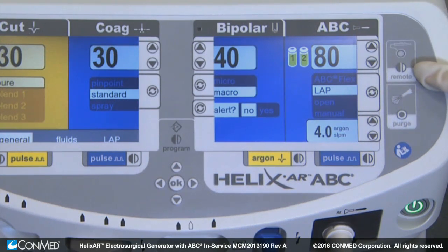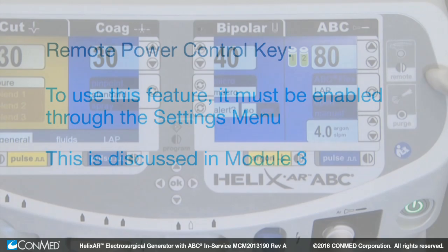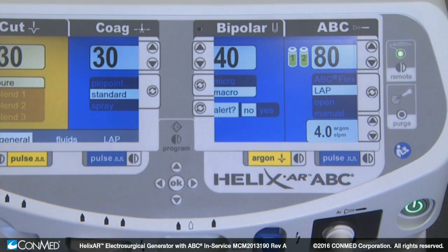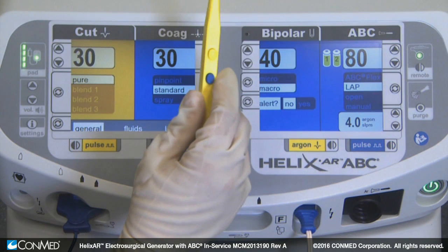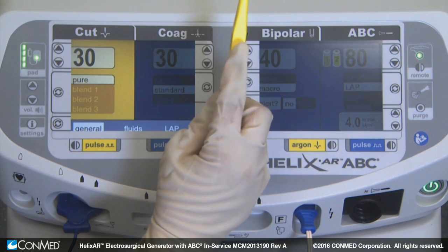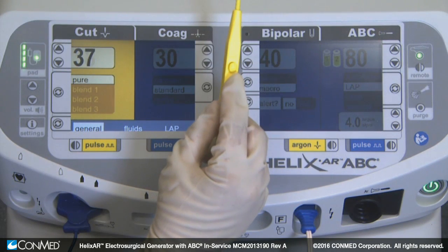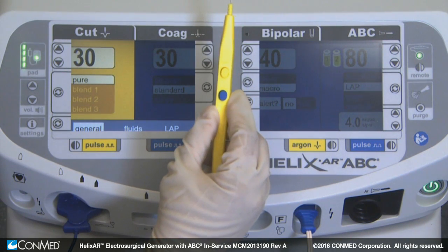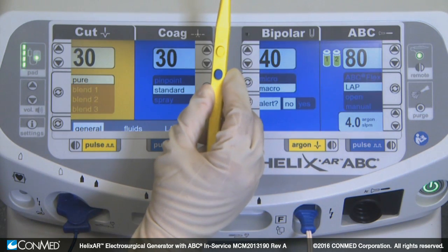On the top right of the generator is the remote power control key. To use this feature, it must be enabled through the settings menu, which is discussed in Module 3. The indicator illuminates when remote power is selected. This allows the surgeon to change cut and coag power settings from the sterile field using an active electrosurgical accessory. The surgeon can double-click the cut, coag, or ABC button on the handpiece, increase power by pressing the cut button, and decrease power by pressing the coag button. The surgeon can then double-click a button to exit, or let this feature time out after a few seconds.